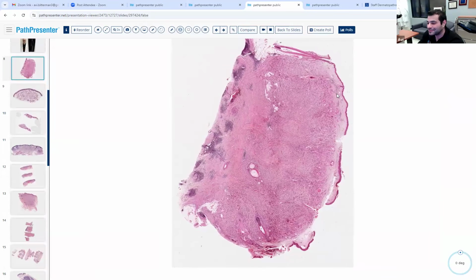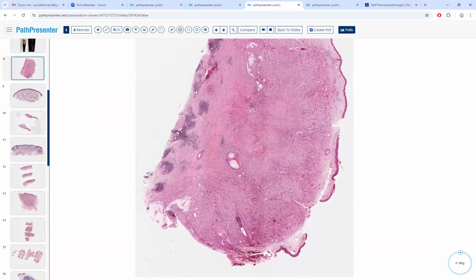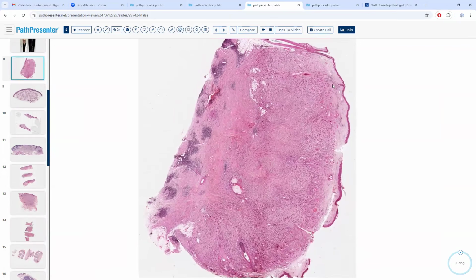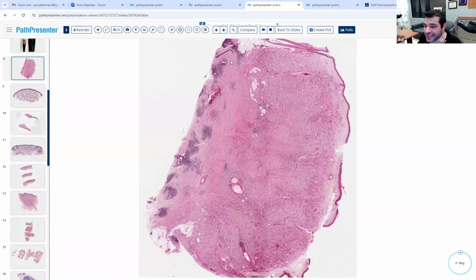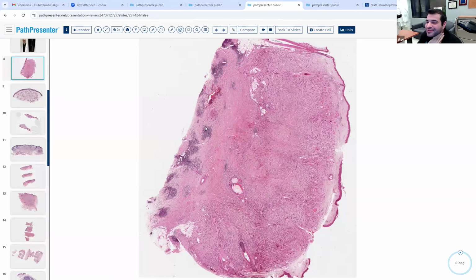So what do we think about this one? Appears to be a kind of eosinophilic, red dermal nodule from the low power. And then I have to really take a closer look. There may be some paisley structures. What else? Anything else you're noticing from low power? Also there may be inflammatory cells. Yeah, all these inflammatory cells. See all these conspicuous aggregates of what kind of inflammatory cell do you think they are?